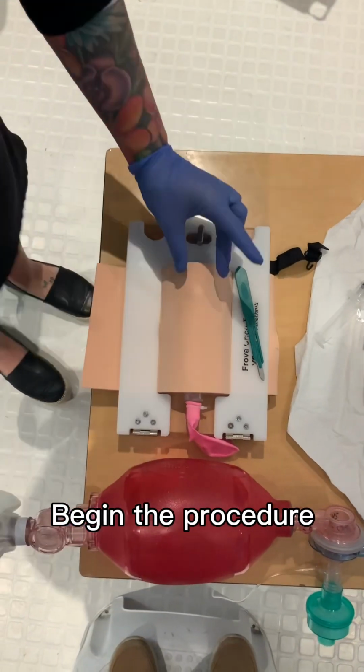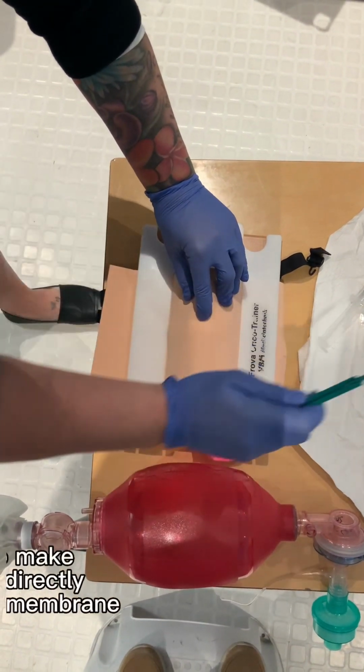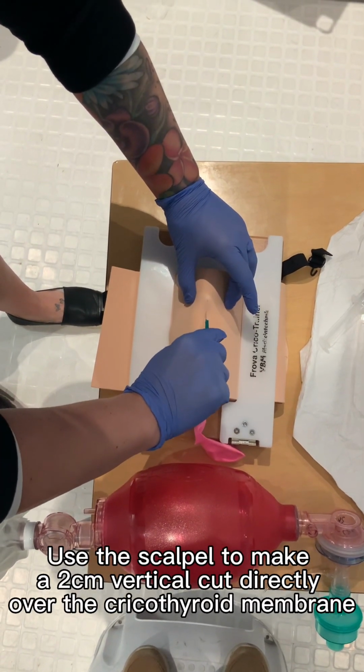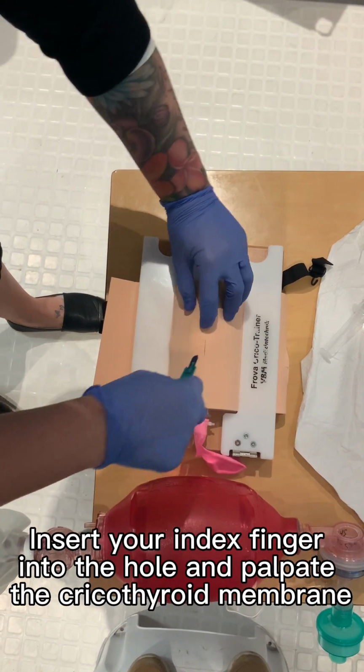Let's begin. Use the non-dominant hand to landmark the cricothyroid membrane. Take the scalpel and make a 2 centimeter vertical cut directly over the cricothyroid membrane. Insert your index finger into the hole and palpate the cricothyroid membrane.